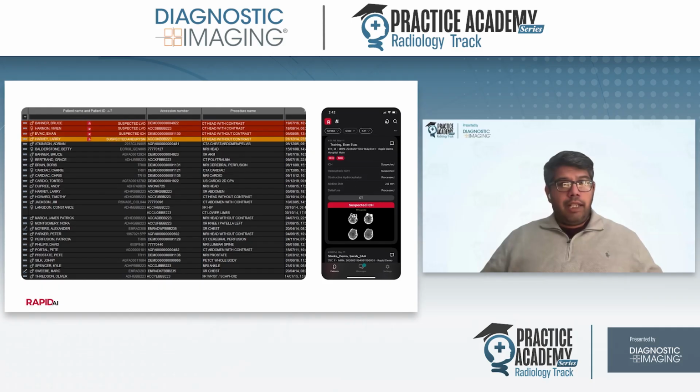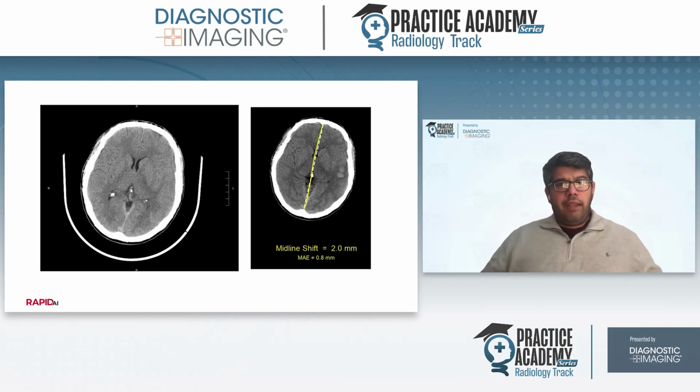So this is what that looks like in practice. We'll work our way through a suspected ICH case and see what that looks like. So we start looking at the case and we see there's a big hemorrhage right here in the left temporal lobe. It's very easy to see.